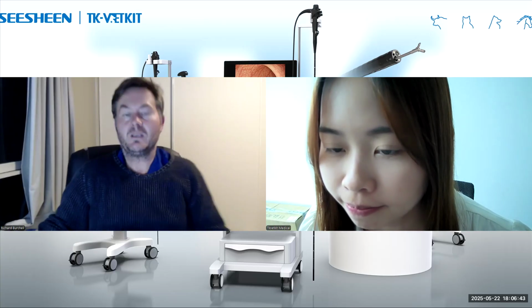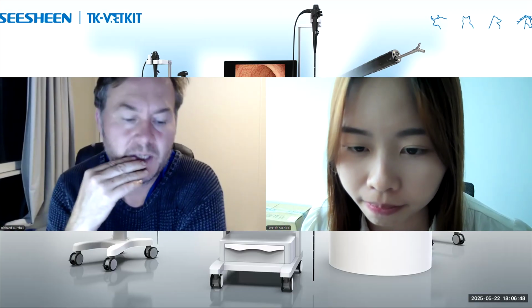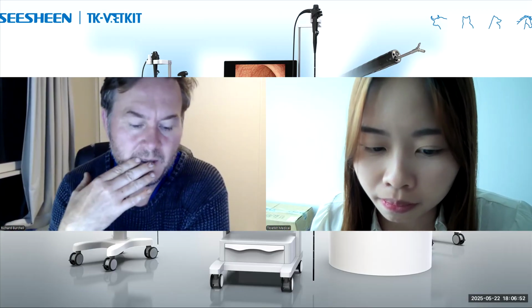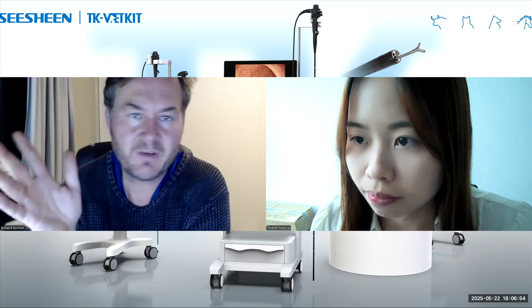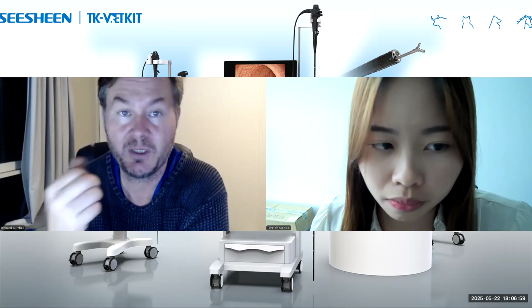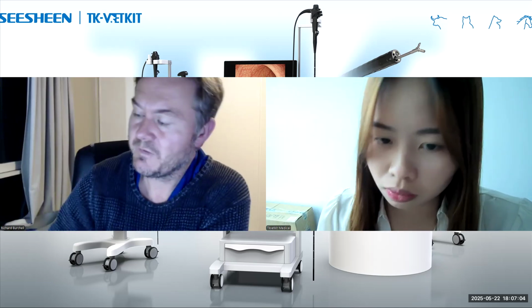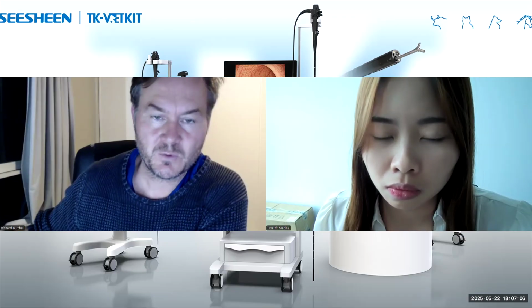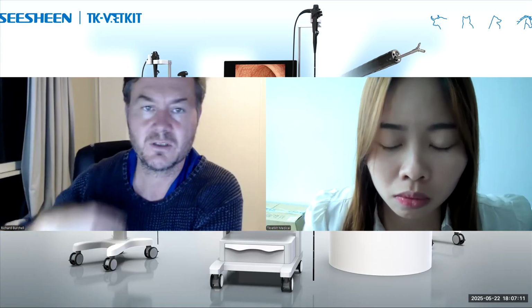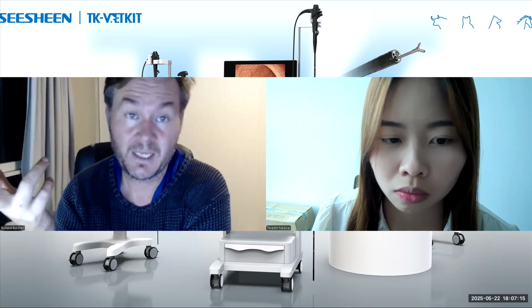Yeah. Something else, just while people are thinking of questions, I think there's huge value in airway evaluation. I'm sure that wherever everybody is, French bulldogs, English bulldogs, pugs, the flat-faced dogs are popular. They are very popular here. And we find so many aerodigestive disorders. So dogs that have got reflux, that have got thick and soft palates, that have got regurgitation and gastrointestinal signs as a result of their airway disease.